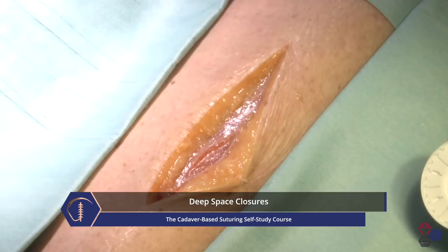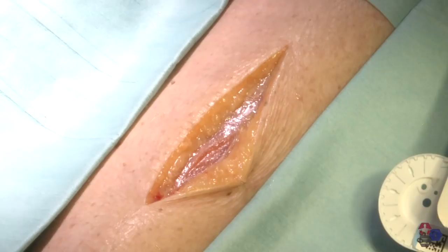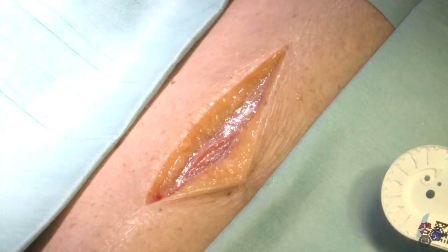I'm going to show you a few techniques to close deep spaces, including fascial planes and deep subcuticular tissue in a layered manner. We don't want to allow seroma or hematoma to accumulate in the deep spaces because they can act as a nidus for infection, abscess formation, and delayed wound closure.